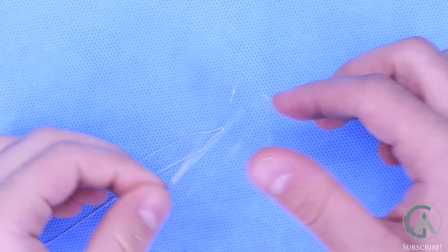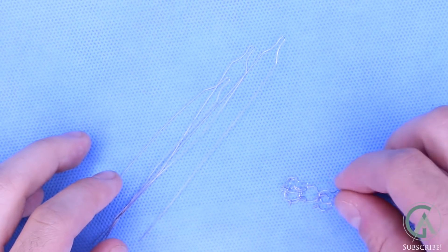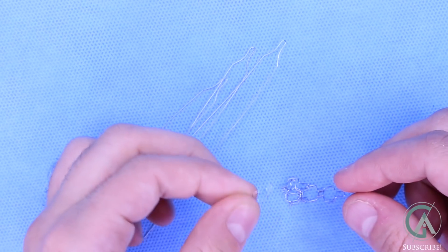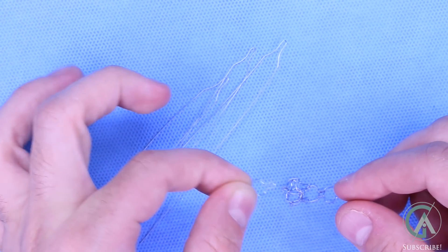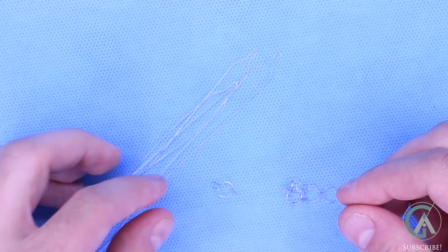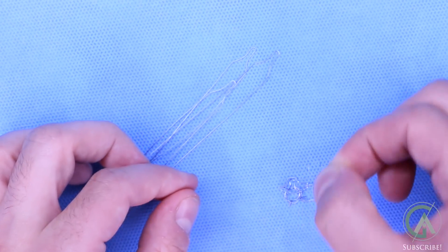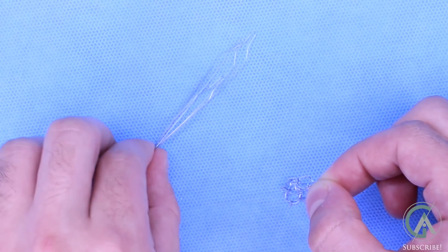Next, let's go ahead and look at steel ligatures. Steel ligatures are a little bit more rigid and they can be used to tie in stubborn teeth that need the wire tied in a little bit tighter. Steel ties come in different forms — we have these longer ones which can be used to tie in several teeth together, and these smaller ones which are actually called shorties. Let's go ahead and see how we tie in an individual tooth using a shorty. The way we tie them in is pretty much the same, but it's a little bit easier to manage shorties.